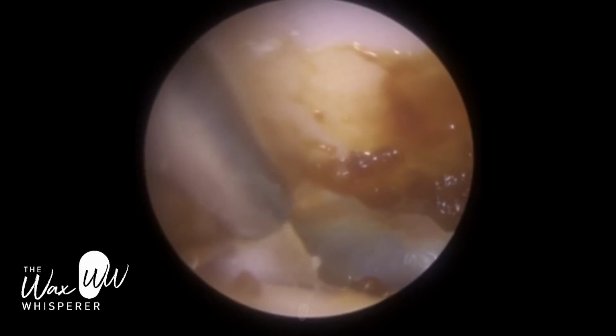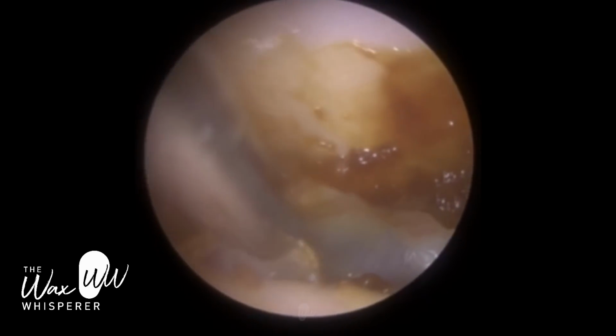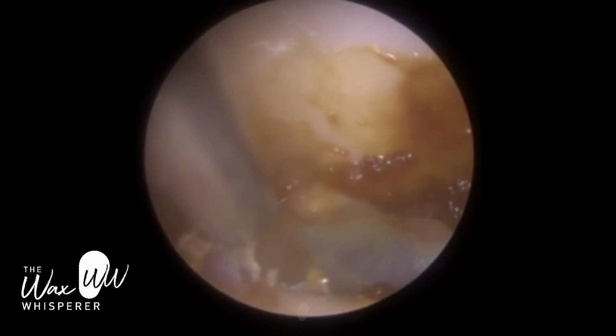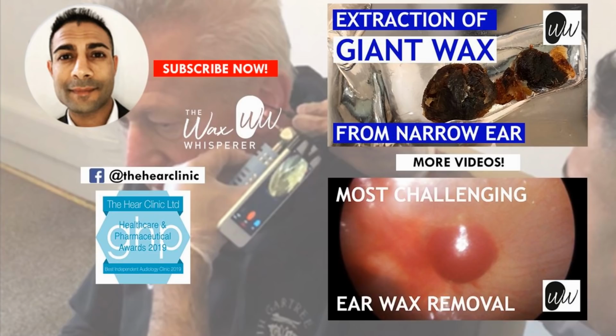Sometimes when we vacuum the ear very, very close to the eardrum in particular, it reduces the ear temperature, which then inhibits the balance organ in this ear. We have a balance organ in each ear, and when we inhibit the balance organ in one ear compared to the other, your brain gets mixed messages from both balance organs, and it thinks you're moving and you're not, and you can get dizzy. And the patient started to experience the caloric effect.